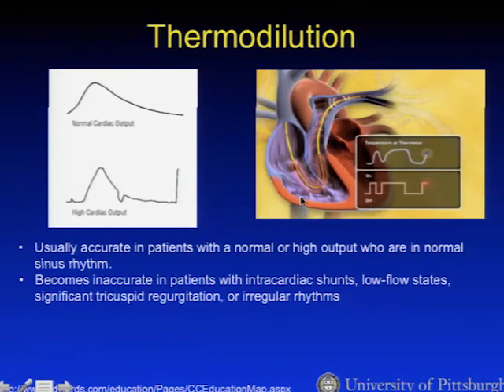This can also be accomplished on a continuous basis using a thermal filament located on the catheter by the same principles. And this is really considered the reference standard and the clinical standard by which all these other methods are compared, even in the face of significant problems with it.